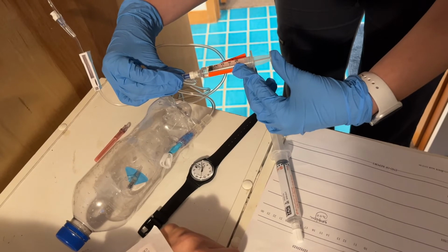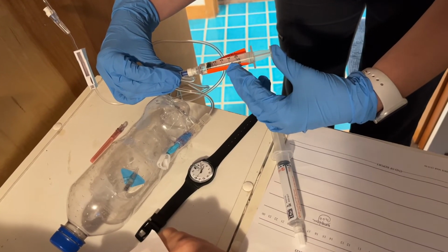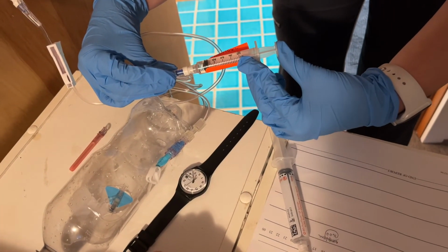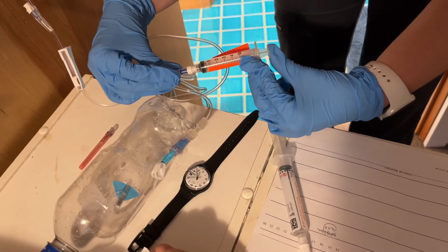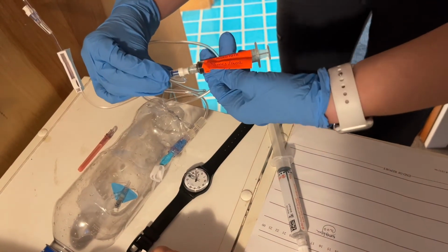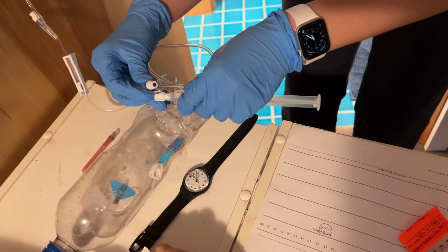And stop until it hits. And do our last ml now. And now I'm going to disconnect the medication, and I'm going to pull out my flush.